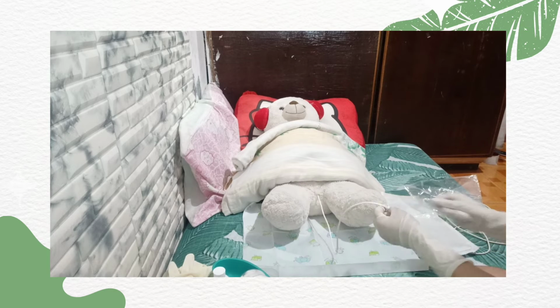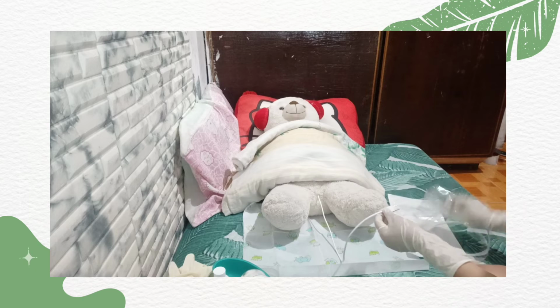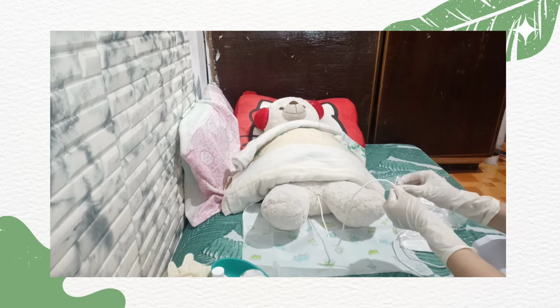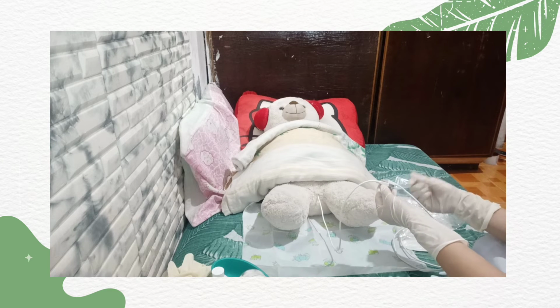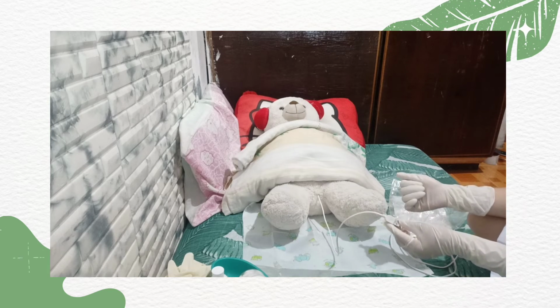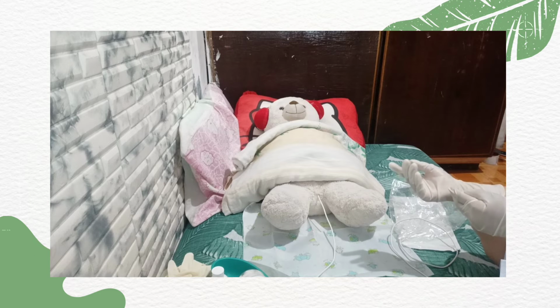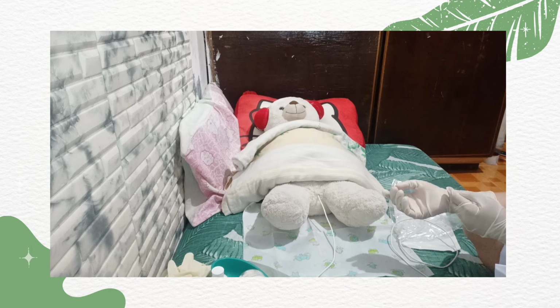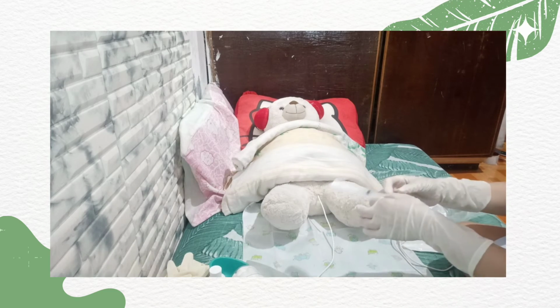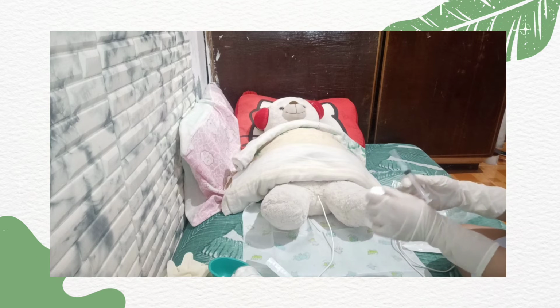Then now we are going to connect it with the urine bag. This is our improvised urine bag. Now I already connected the catheter and the urine bag. Next, let's inflate the balloon with at least 10 to 15 cc of sterile water using a 15 to 20 cc syringe. Then secure the indwelling catheter by taping it to the patient's thigh. Let's assume that this is a 20 cc syringe and this is the sterile water.